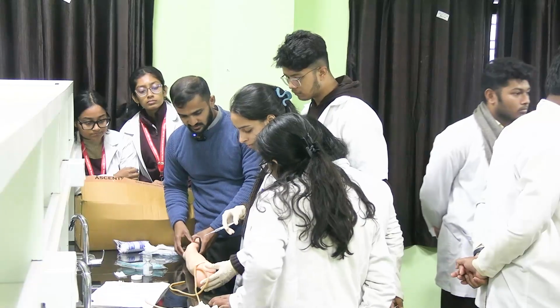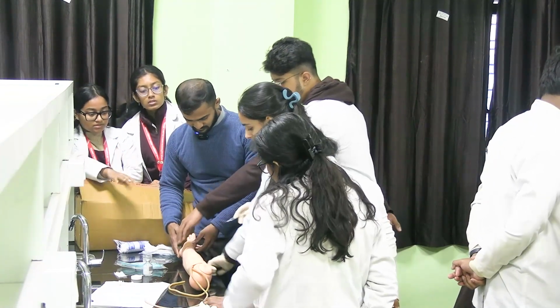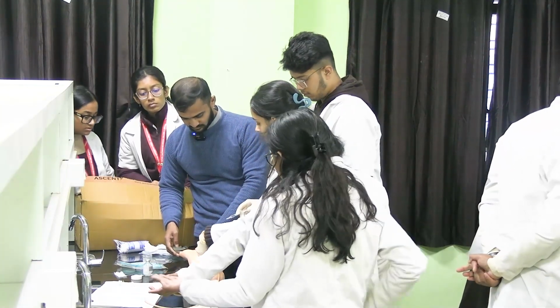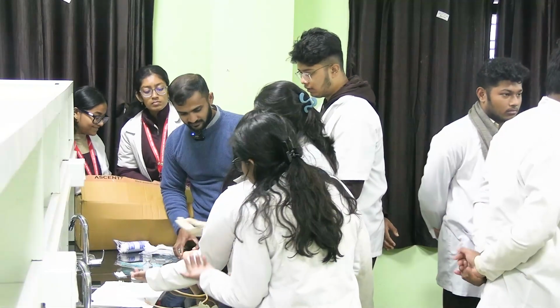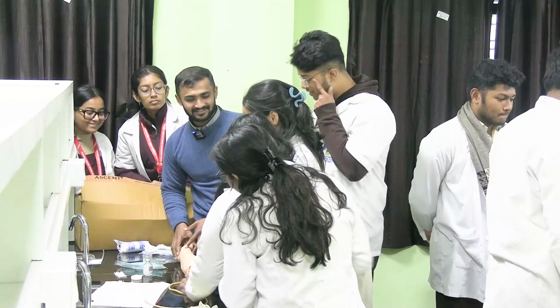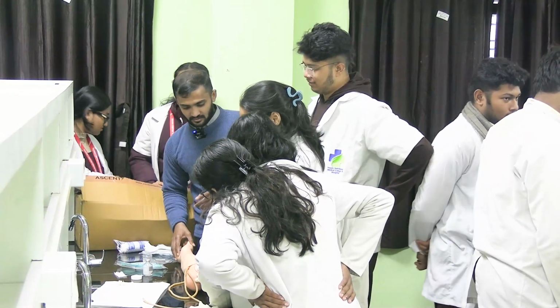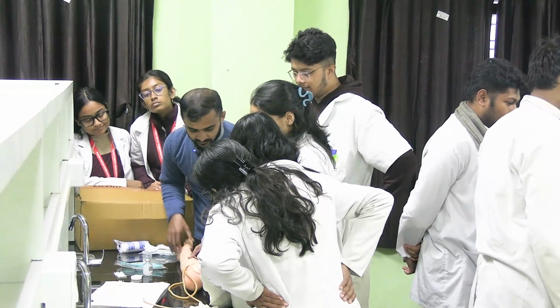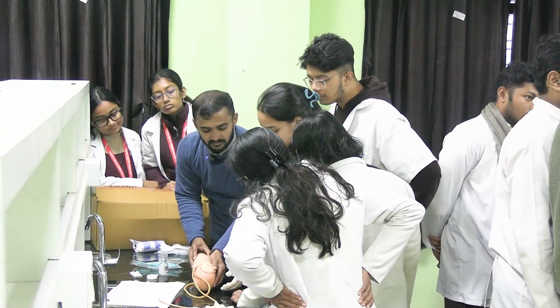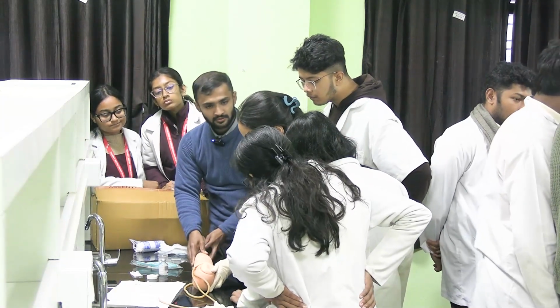So which is the lateral side? This is lateral. But the deltoid is in the middle; there is an anatomical mismatch here. So if this is the deltoid, suppose I am considering this is the medial and this is the lateral. So stretch this side. This way you will stretch. After stretching, you know the site of location where you will be injecting it.